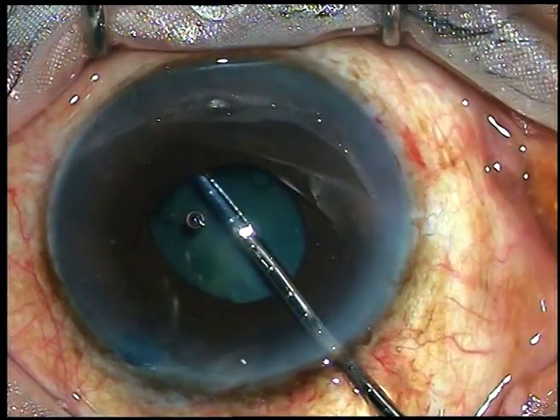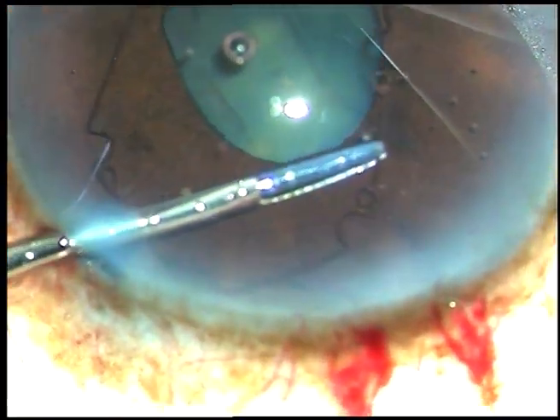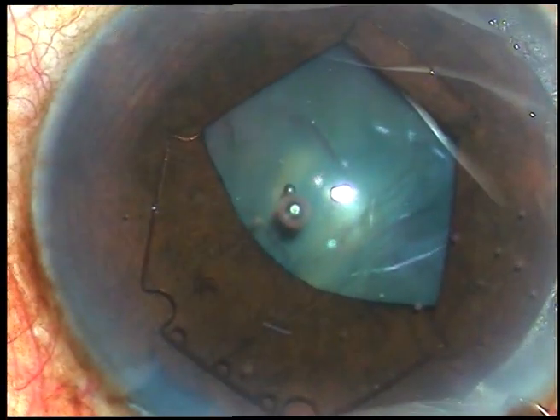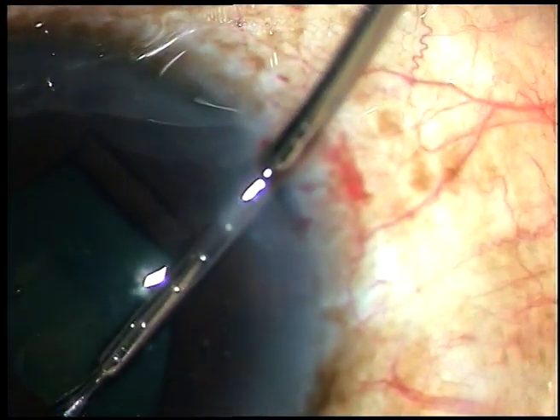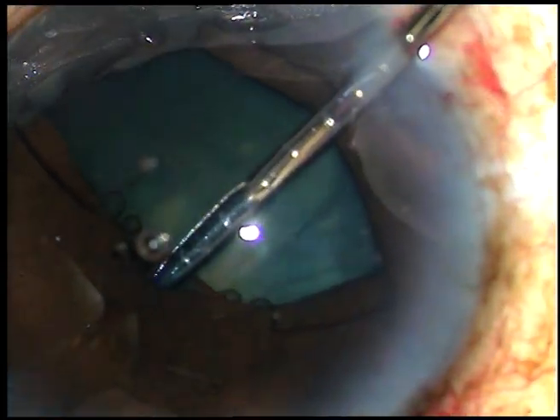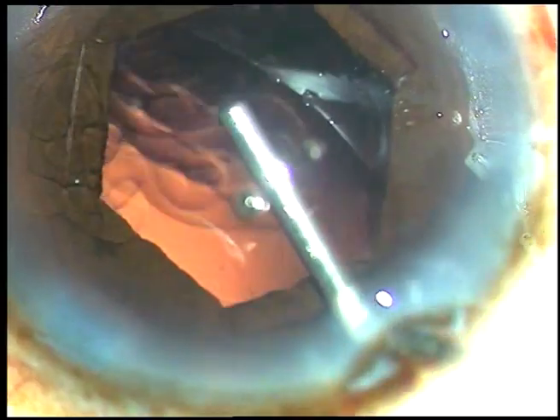If it goes like that, then you can tuck the leading flange in one go. Then you tuck the other flanges. Alternate flanges are tucked. Just use these 23-gauge crocodile forceps recommended by the inventor of this device, Dr. Suvin Bhattachachi. Now this is the third flange. Hold it like this and tuck. Once you do this, you are ready for capsulorhexis and phacoemulsification.